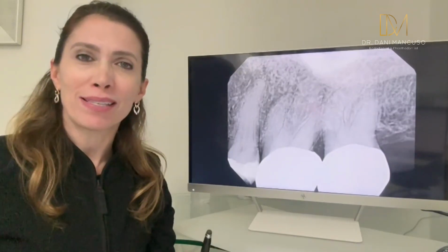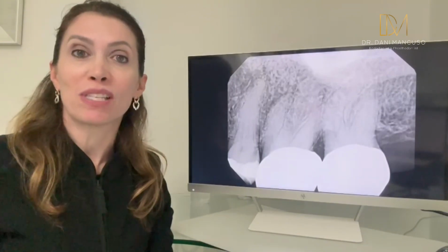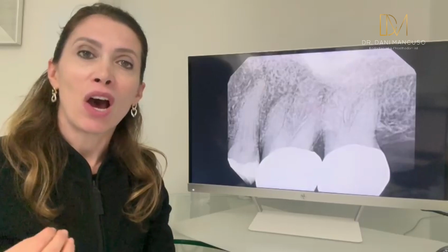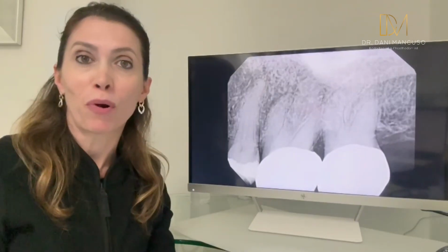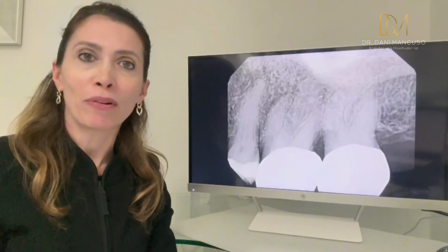So it's always something when we assume that the GP will fit because we are using the same system as the file, but the canal is unpredictable and a not well done obturation can bring lots of problems to that treatment and the treatment can fail. So let's talk about gauging now.